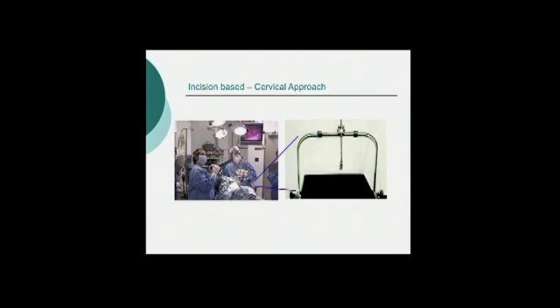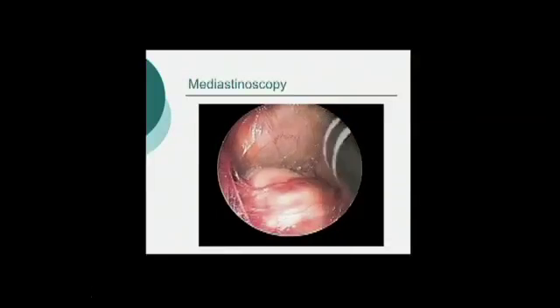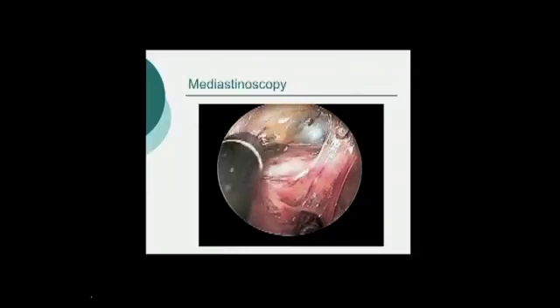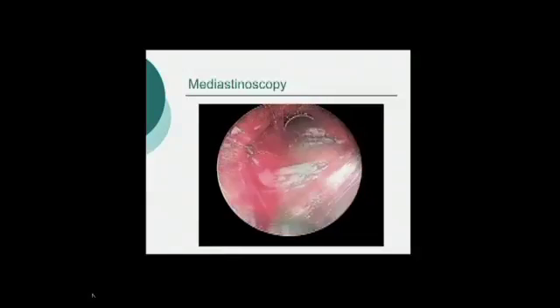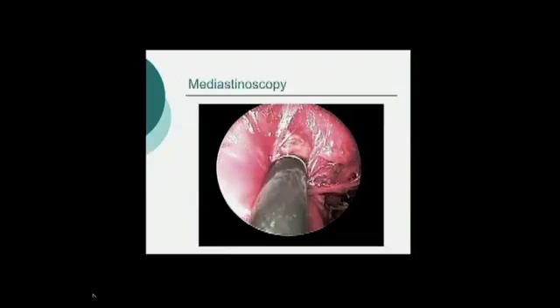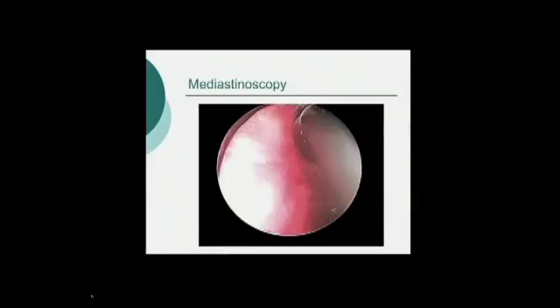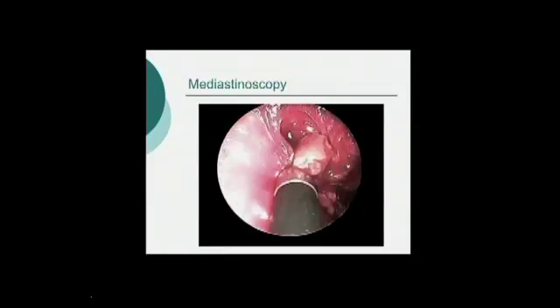This is an example of the setup of an incision-based cervical approach to mediastinal parathyroids, using a special sternal retractor that helps you get your working space. In mediastinoscopy, the trachea is at the bottom of the screen and the innominate is in front of you, providing beautiful visualization. The one problem with mediastinoscopy is that you really just have one working instrument, so oftentimes you have to suck out the parathyroid gland and it comes out in pieces. It's important to get the entire parathyroid gland out if you approach it in this fashion.